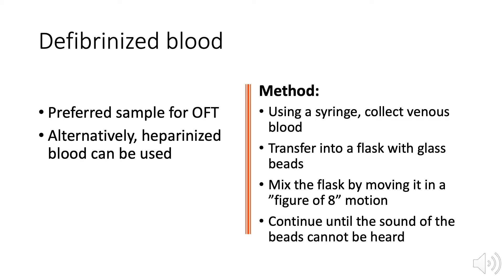Both of these methods use defibrinized blood. Fibrin is a factor used in the clotting process, so to remove fibrin, collect venous blood using a syringe, then transfer the blood into a flask with glass beads. The glass beads activate the clotting process. Agitate the flask in a figure-of-eight motion — you'll notice the glass beads make a sound as they hit the walls. Continue agitating until the sound of the beads can no longer be heard, meaning the beads have sufficiently activated clotting and fibrin strands have formed clots around the glass beads, which dampens the sound.